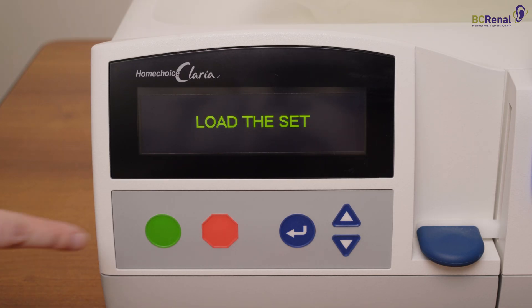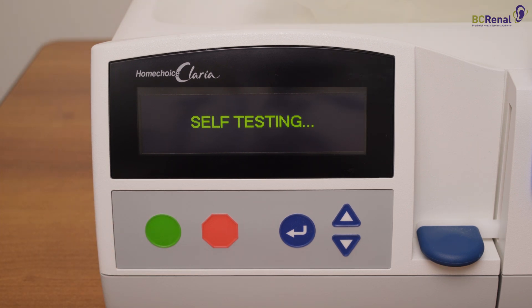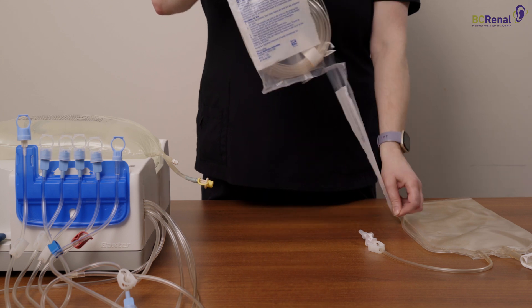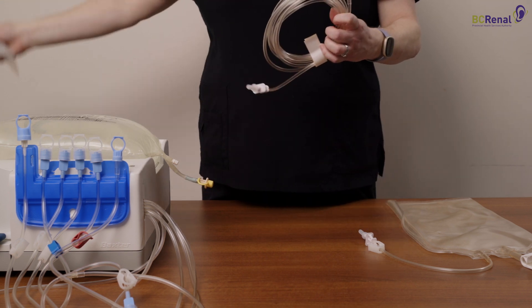Press the green button. The Cycler will now say 'self-testing.' The Cycler is testing to make sure that the cassette is functioning correctly; it will take approximately 5 minutes to complete the self-test. During this time, you can continue to set up the Cycler by getting the drain line ready. If you are using the drain line extension, open the package now.